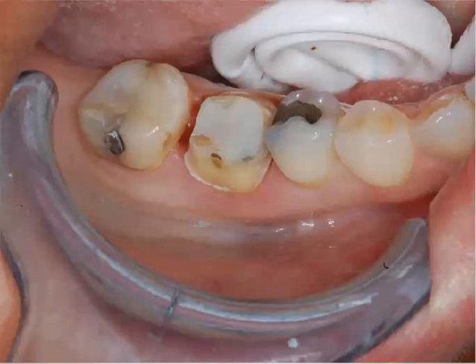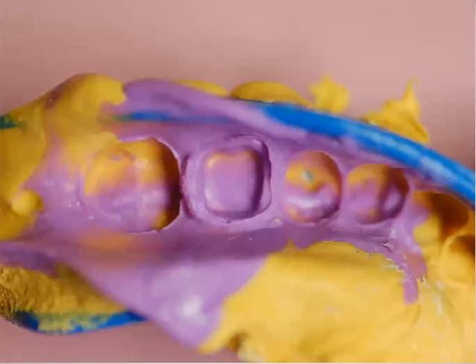And usually once you remove the cord, you'll find that you have a clean, dry feel. There's no residue left there. Now it's just waiting, inviting for that light body to be injected into the subgingival areas. And that's our final impression.